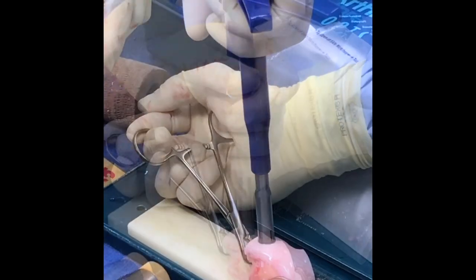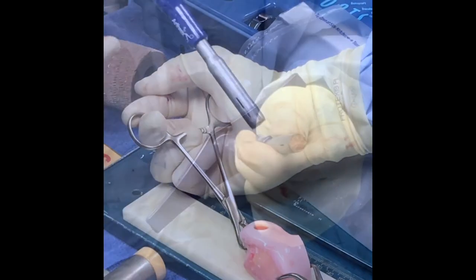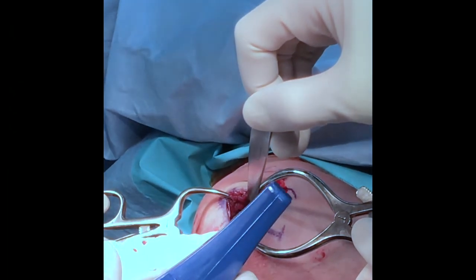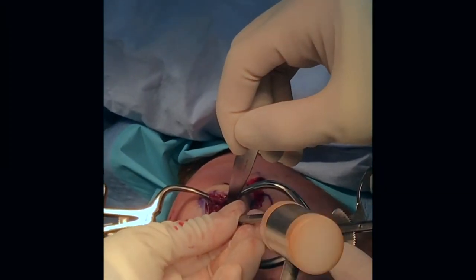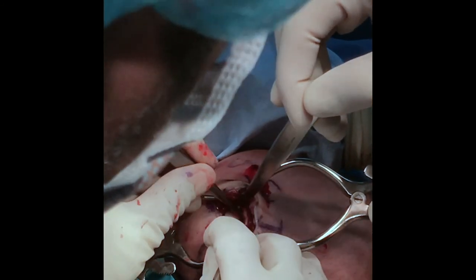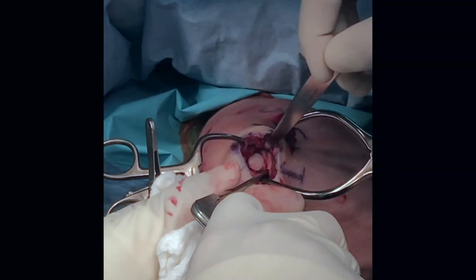Instrumentation is used to extract an osteochondral plug, and this instrumentation allows gentle insertion of the osteochondral plug by advancing it into the lesion. Gentle tapping then allows implantation flush with the surrounding cartilage.